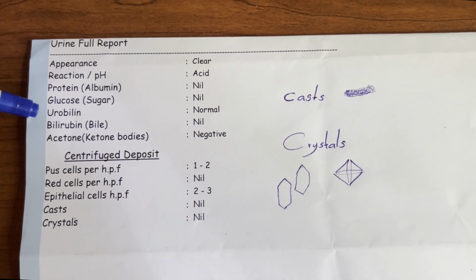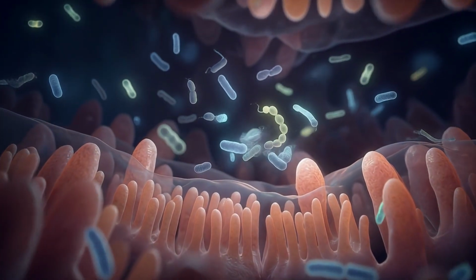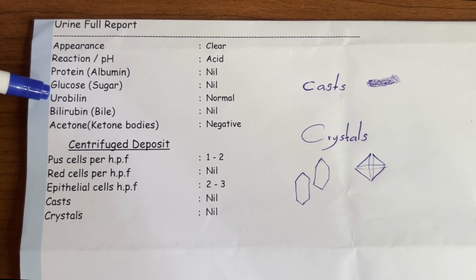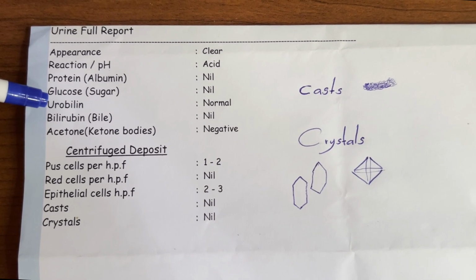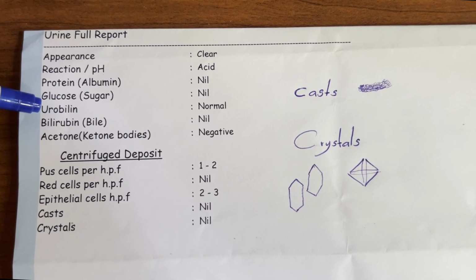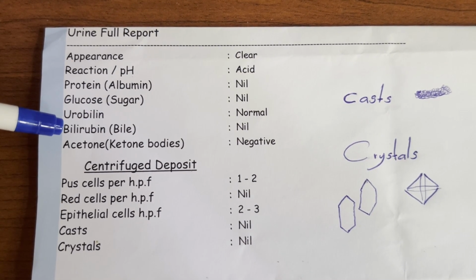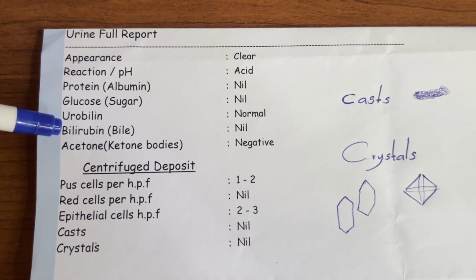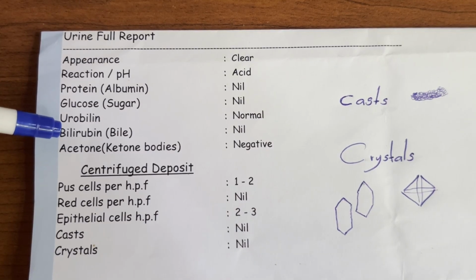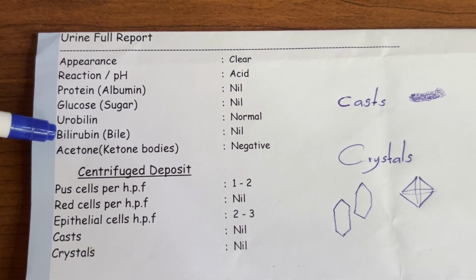These two parameters evaluate hepatic and biliary clearance. Urobilin, produced by gut bacteria breaking down conjugated bilirubin. Trace levels, normal, are standard. Elevated levels suggest hemolytic conditions or early hepatocellular damage, while total absence can indicate complete biliary obstruction. Bilirubin, conjugated bilirubin, should always be nil because it does not normally cross the renal barrier. A positive result indicates hepatic pathology, such as hepatitis or cirrhosis, or obstructive jaundice, where gallstones block the common bile duct.